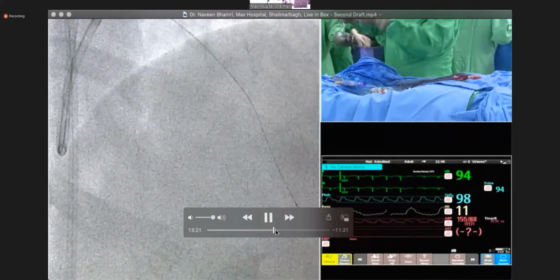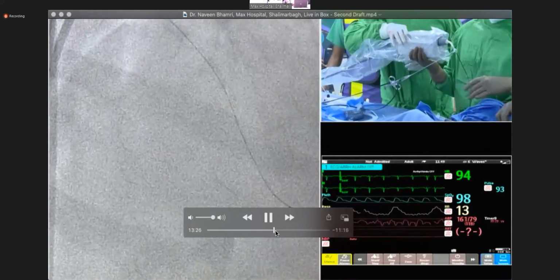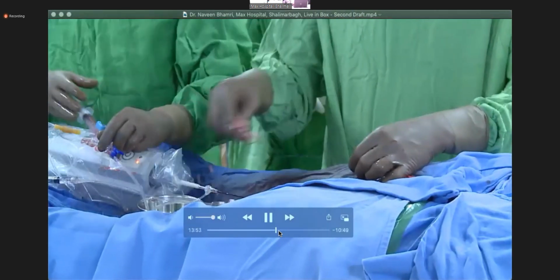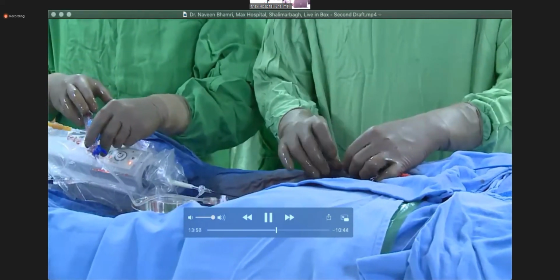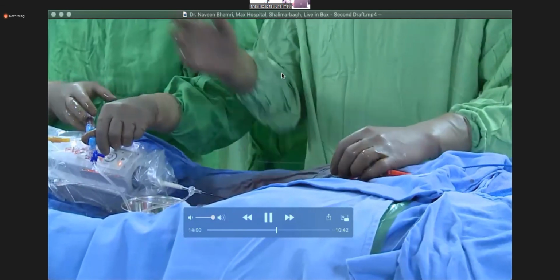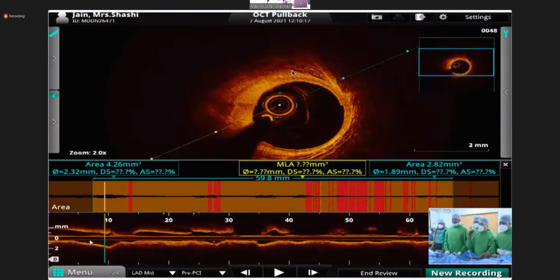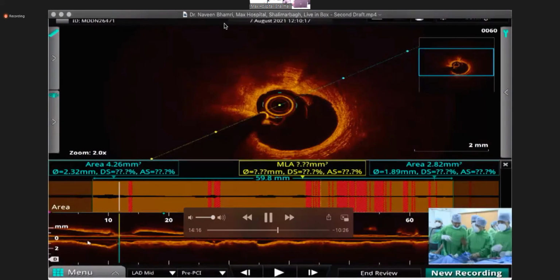So now we are on with the Dragonfly catheter inside the LAD. 50 millimeter is the length of these proximal two markers. The distal black marker is the tip of the catheter. So even we can have it with the 55. So we are injecting the dye. Shoot. So this is, you can see the distal end of the LAD. This is clear. Nitro. Now you can pull it back.